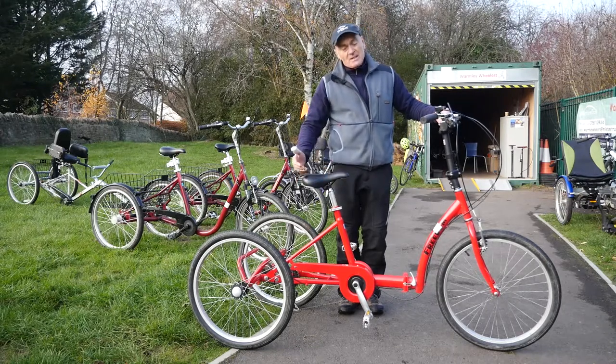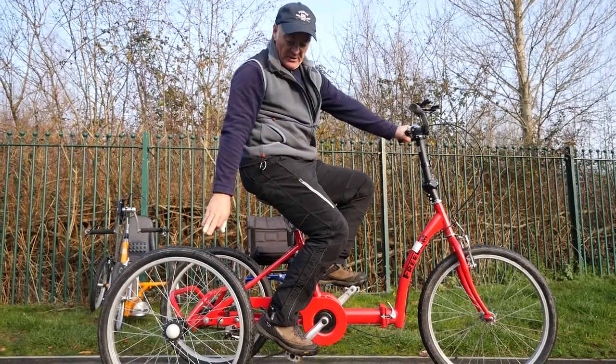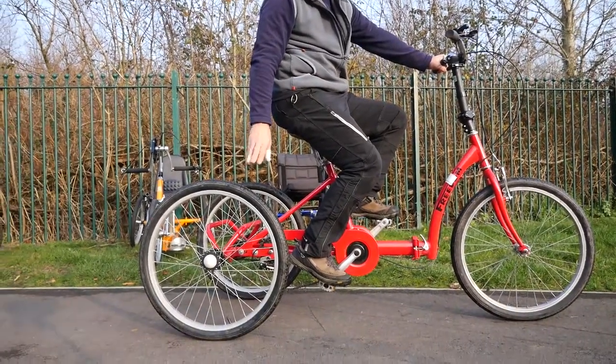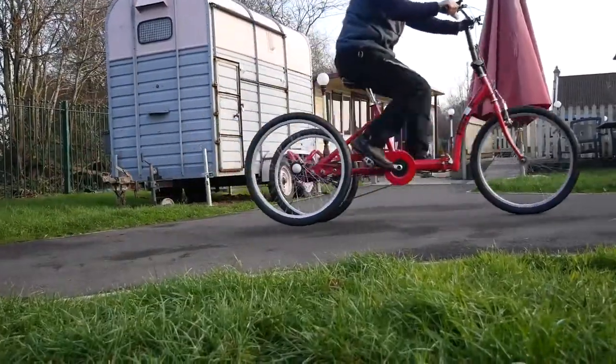Because it's a trike it's quite easy to lift one of the back wheels. If you turn too sharply at speed you will lose one of the back wheels — and I'll just demonstrate that to prove the point. So you've seen what happens if you turn a bit sharply at speed. There is a risk if you're not aware and not sensible, so for service users that can follow verbal commands like 'slow down' they're fine, but that element of risk should be understood.